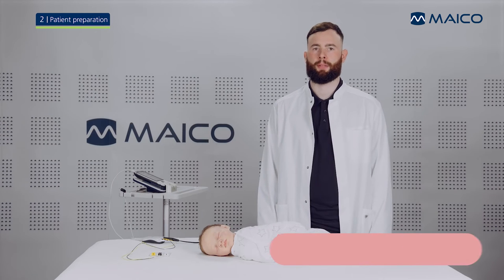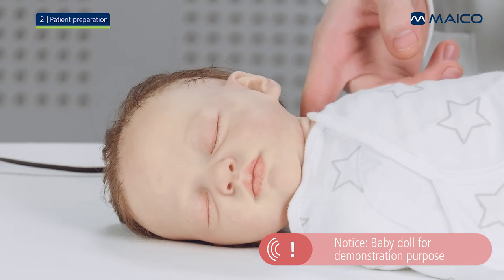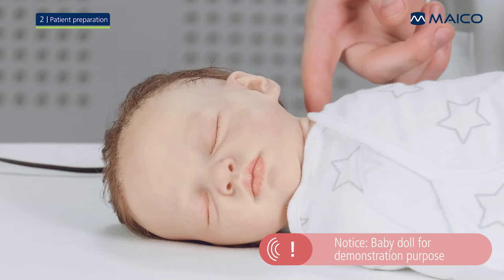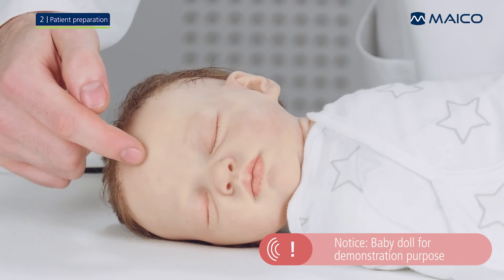The baby needs to be prepared before performing a screening. Locate the electrode spots: one centered on the back of the baby's neck, one on the cheek, and the third on the center of the forehead in front of the hairline.